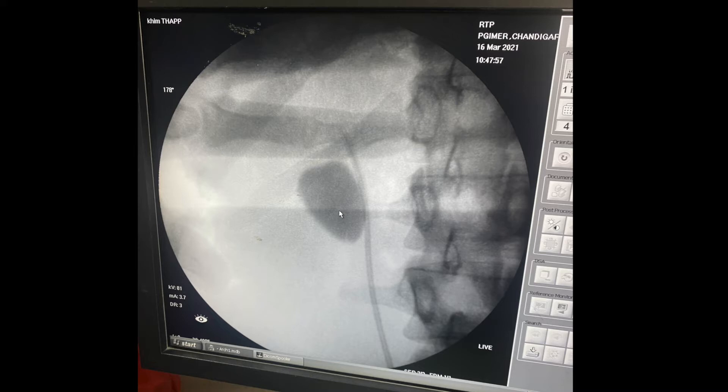This is a case of left-sided renal stone disease demonstrating how to identify a mid posterior calyx while doing prone PCNL. In the image provided, there is a solitary pelvic stone with a ureteral catheter in situ.